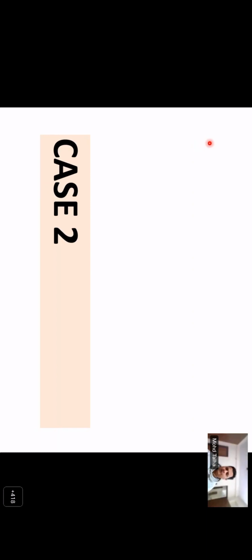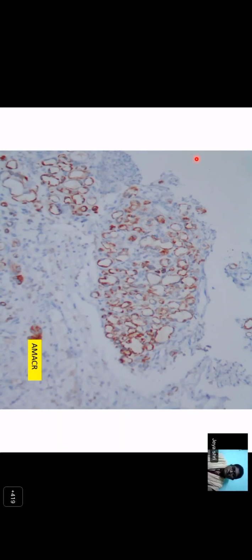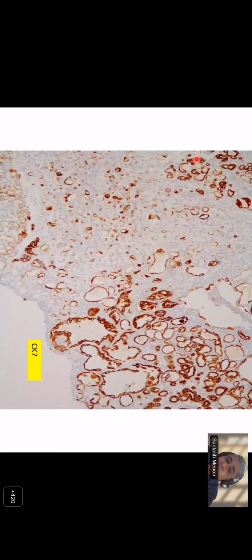First question: was the tumor well circumscribed or not? It wasn't very well circumscribed, to be very frank. You can see on the morphology it's not a circumscribed kind of lesion. These are single-looking cells, signet-looking cells, which are just haywire. But in general, it was not looking very infiltrative. We had small tissue bits which were fragmented, so circumscription was not what we were looking for in this.